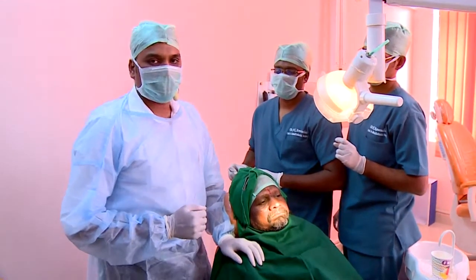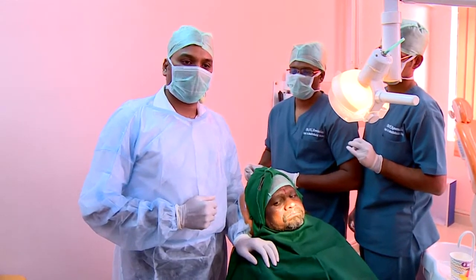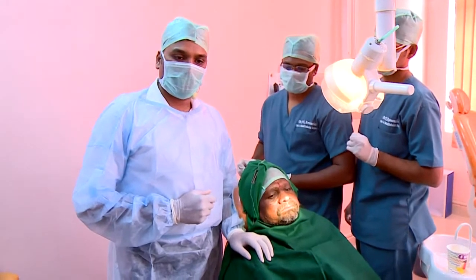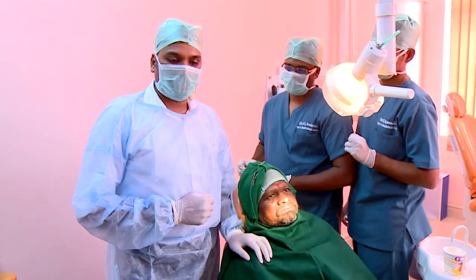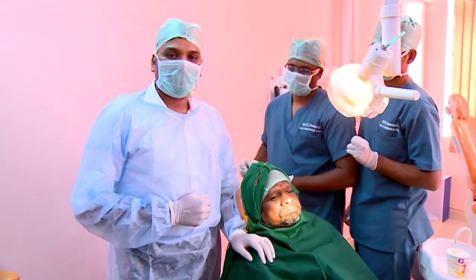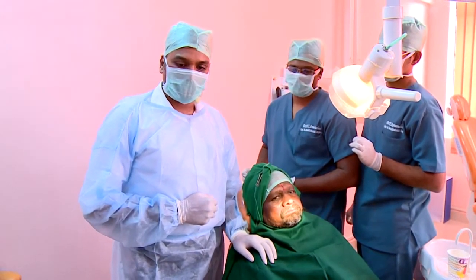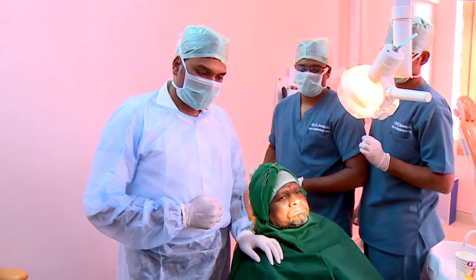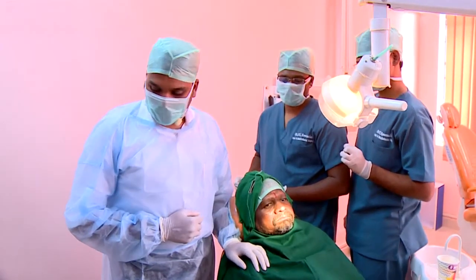So a biopsy specimen is going to contain three parts. One, the mucosa and submucosa of the normal mucosa, as well as the mucosa and submucosal part of the fibrous bands here. All of these have to be taken in toto and given to the pathologist. That's going to help them in differentiating between the diseased and fibrous tissue. So with this introduction, I think we can move on to the procedure. Bhagat sir, any questions there? Yes, we can start with the procedure.